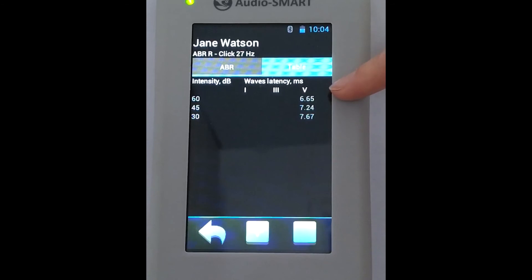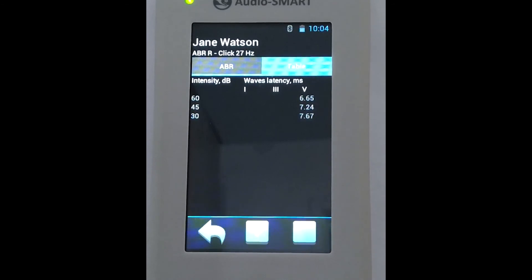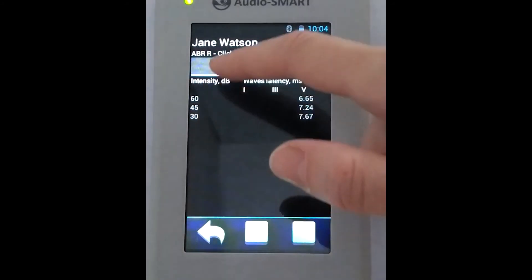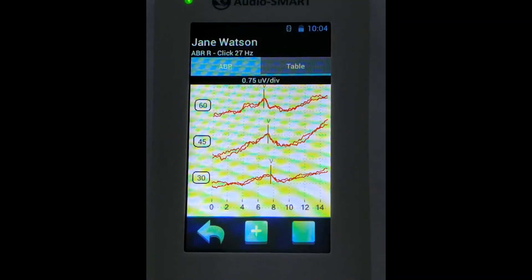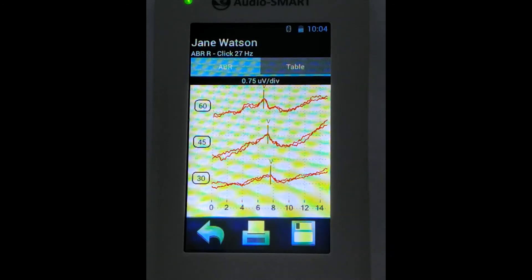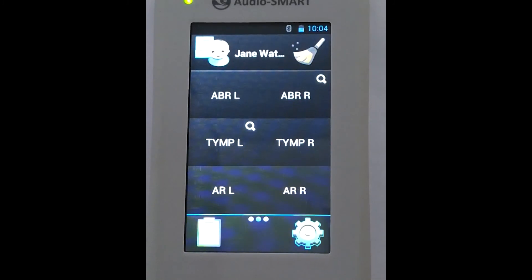We see the latency becomes longer as we make the intensity level lower — this is normal. We go to the traces window. We can save the results if we don't need to register anything else, print via Bluetooth printer, and also export the results to the PC in the Neuro Audio Screen program.